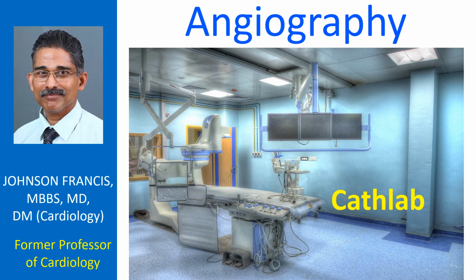Angiography is the procedure by which blood vessels of the body are visualized by injecting contrast or otherwise. Most popular contrast media are iodinated dyes which cast shadows of the vessels on X-ray imaging. Dyeless angiography is possible with magnetic resonance imaging, where the signals from the moving hydrogen particles in blood give the image. This is known as magnetic resonance angiography.